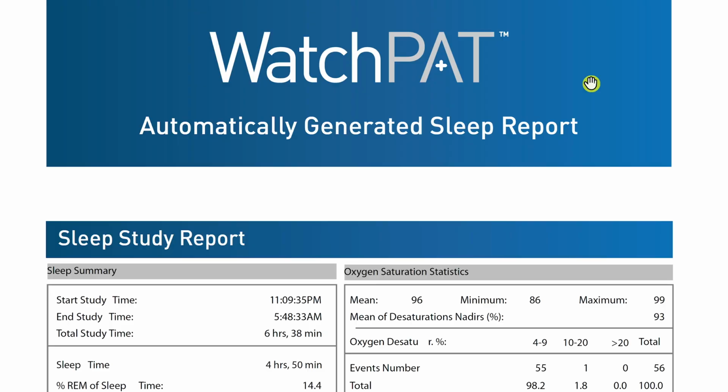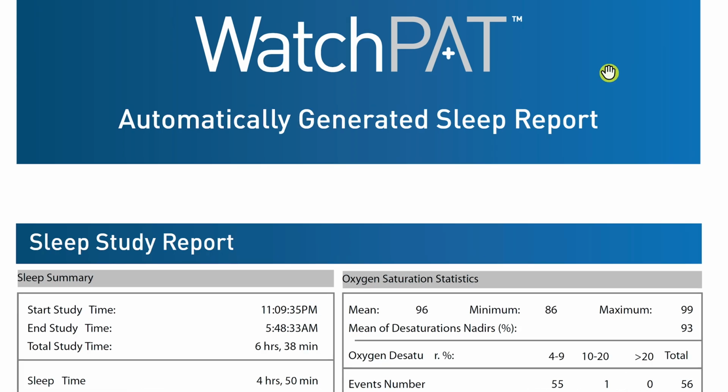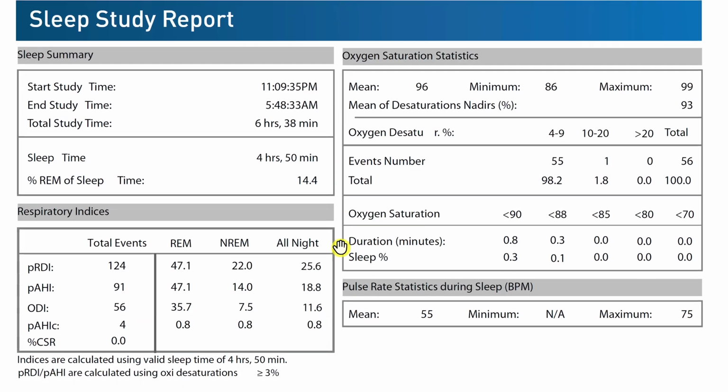A top contender for one of the questions I get the most. By the time I'm finished with you guys, you're going to be the ones out there answering the question of, can someone explain my WatchPAT test for me? So let's just jump right into it. I don't like to waste time. You guys don't like to waste time. We got sleep disordered breathing to cure.